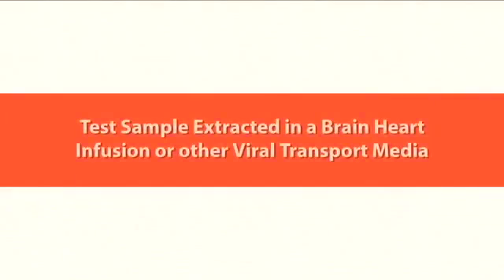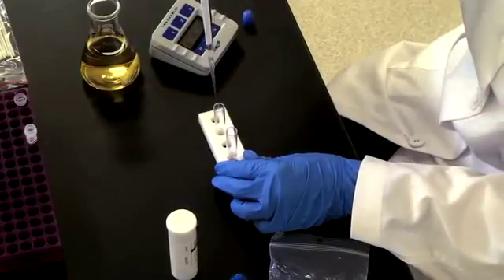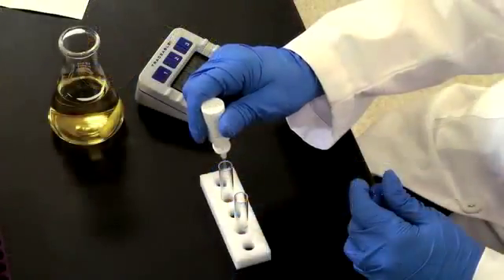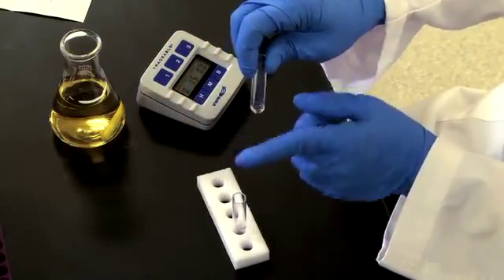If sample extraction was performed using BHI broth or another viral transport media, use the following method to test samples. First, place 200 microliters of the viral transport media containing the extracted sample into the test tube provided. Next, add 3 drops of extraction buffer to the test tube. Tap the side of the tube to mix.